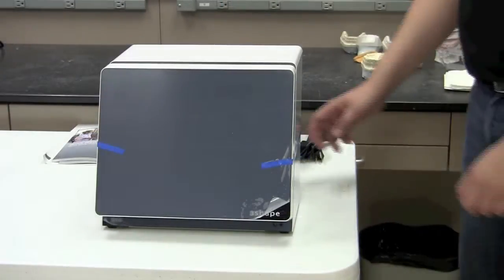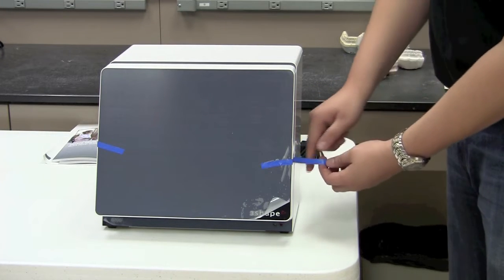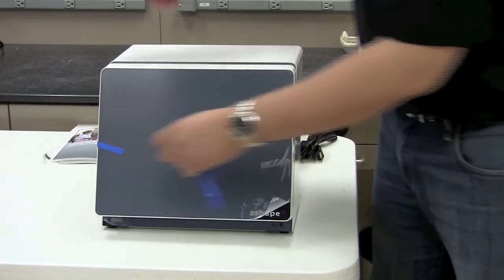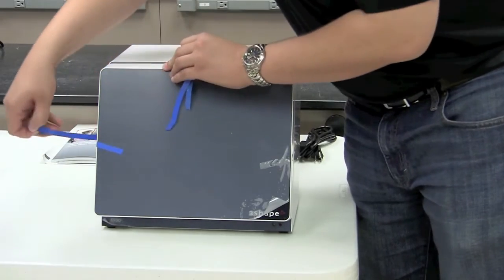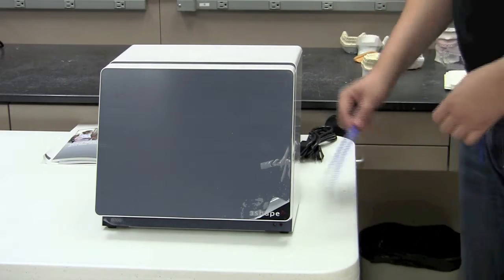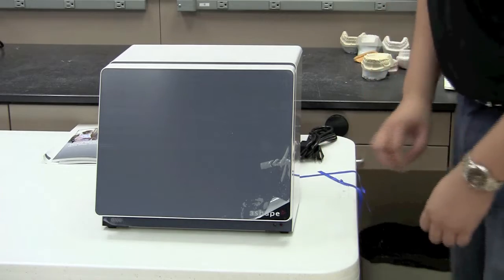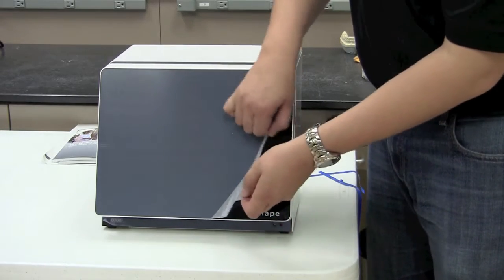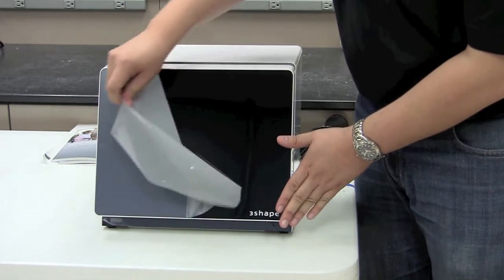Next, remove these blue tabs or pieces of tape that hold the scanner door in place during transit. Set those items aside. If you want, you can also go ahead and remove the protective film from the scanner door — just make sure you hold it in place while removing it.